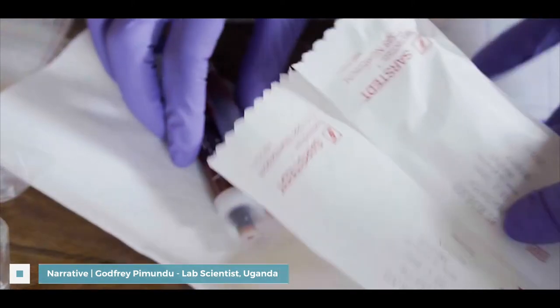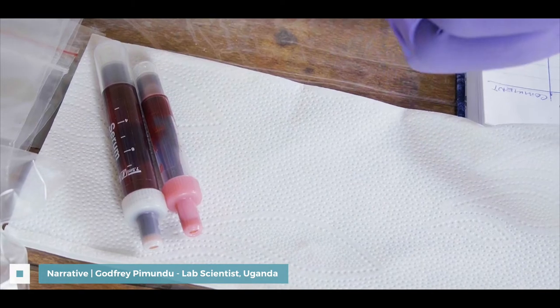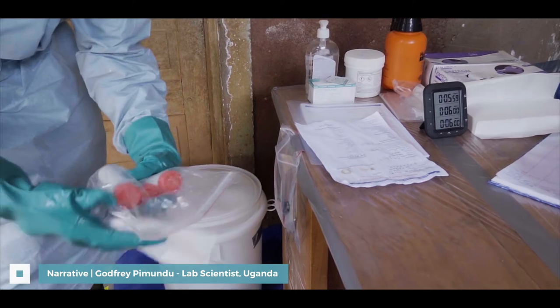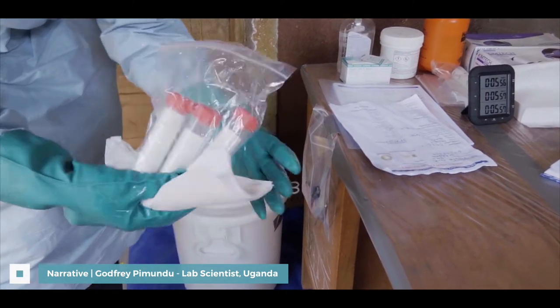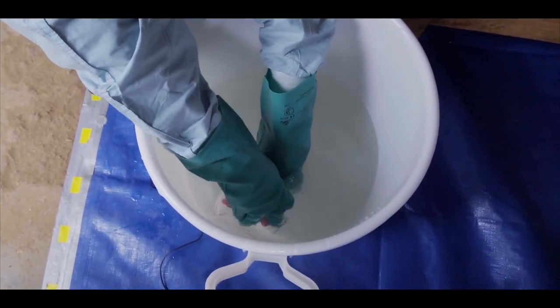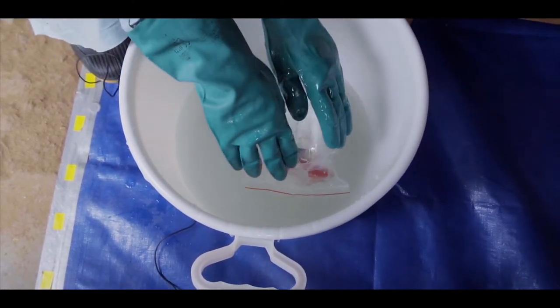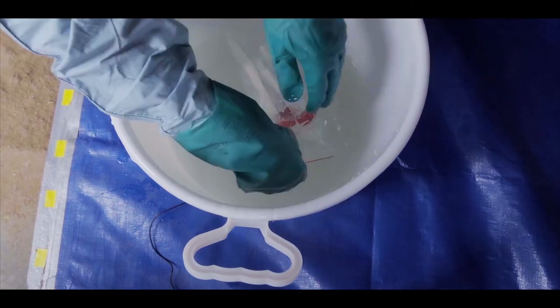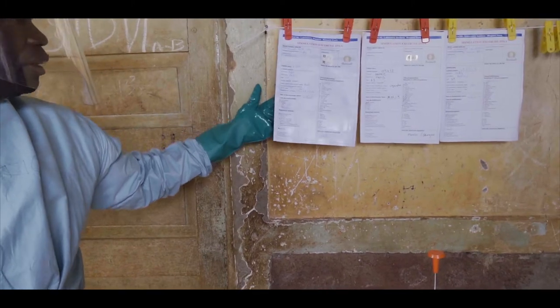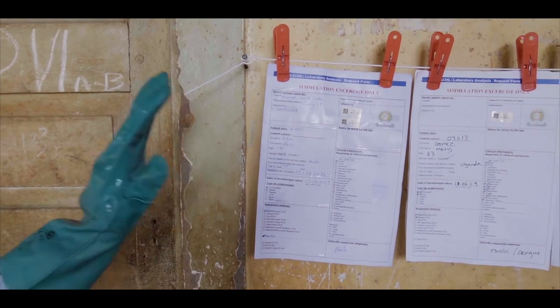When we get samples from health facilities, they come packaged. What is very important is that these samples must be submerged in 0.5% bleach so that we can destroy any contamination on the surface, including the forms. As you can see, this form is wet — it is a special form that can go into bleach and not get destroyed.